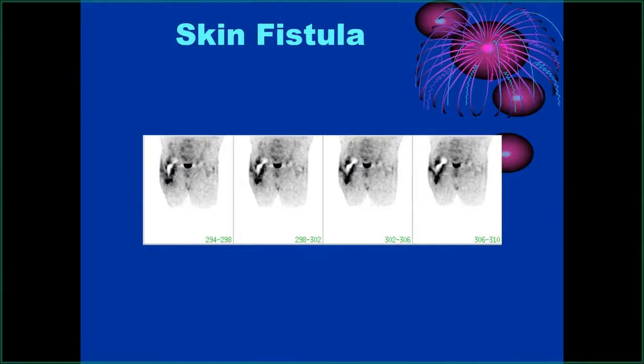This is a patient with a skin fistula, and having high-resolution images provided by PET-CT allows you to see very clear-cut evidence about the extent of the disease, how it spreads to the adjacent structures that you cannot detect by conventional single gamma emitter approaches.